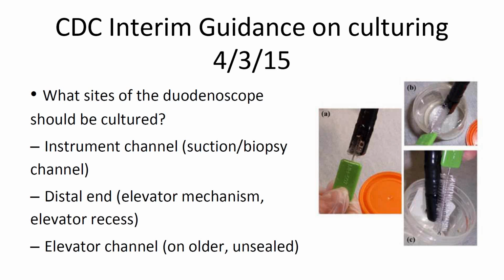As our final poll question, can you please tell us, are you presently culturing any of your endoscopes? This would be on some sort of routine basis, periodic monitoring. Okay, thank you. So we see about 22% of those on the call are culturing endoscopes on some basis. And again, we can't tell with this what the basis is. And 78% are not culturing endoscopes.